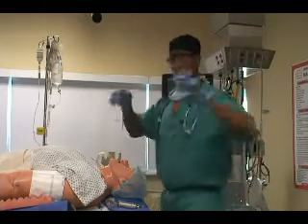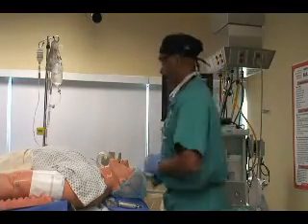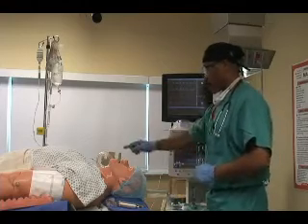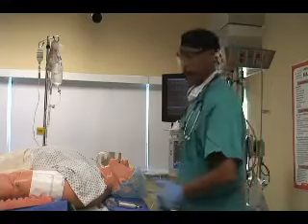So, we're going to start with having your personal protective equipment: goggles, gloves, mask. Then you want to make sure equipment is assembled. Your suction, oxygen source, and then your laryngoscope, ET tubes, airways.